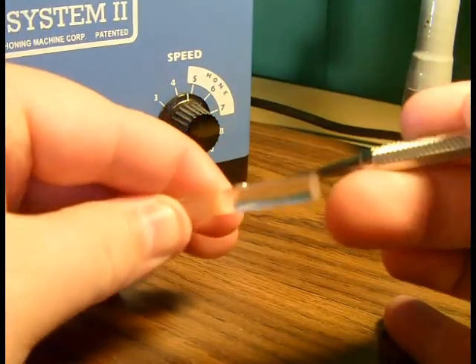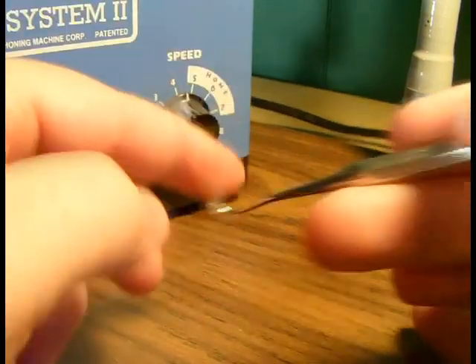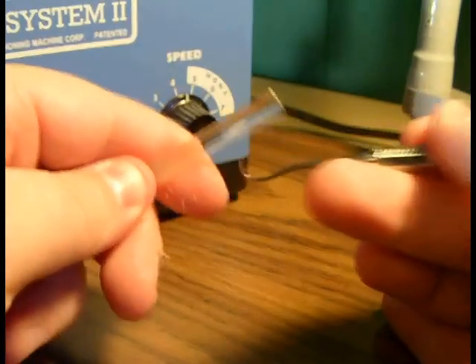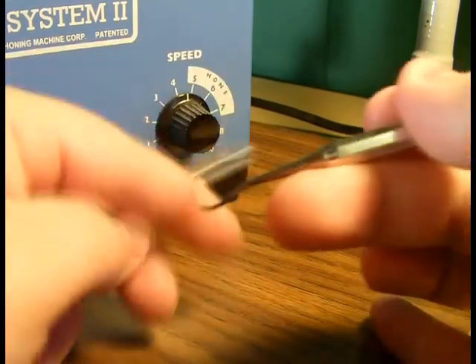Now that we have finished sharpening the instrument, we're going to test it. Notice how the instrument grabs the plastic strip. We're going to test both sides as well to make sure that we've got a nice, good edge.